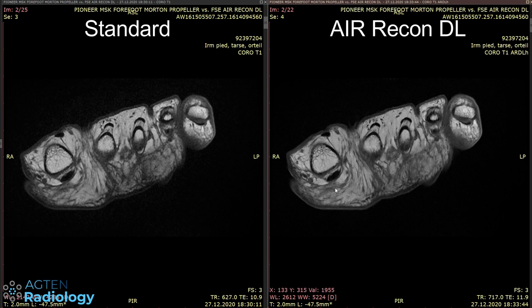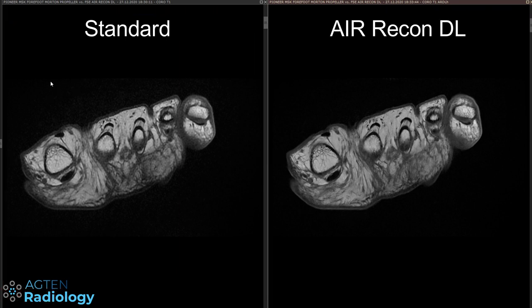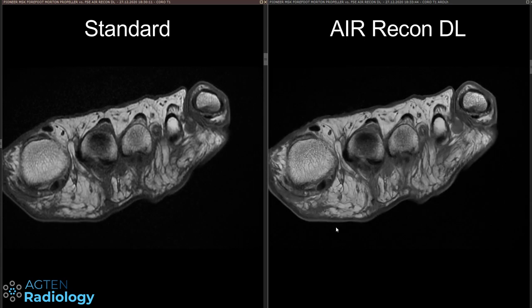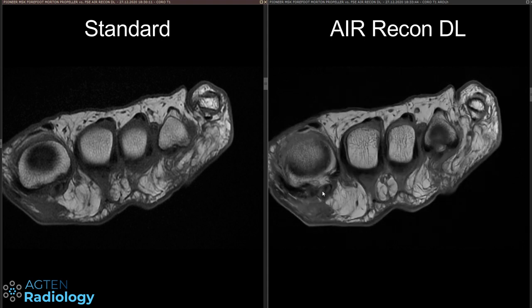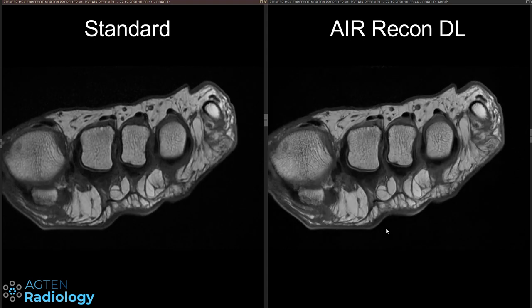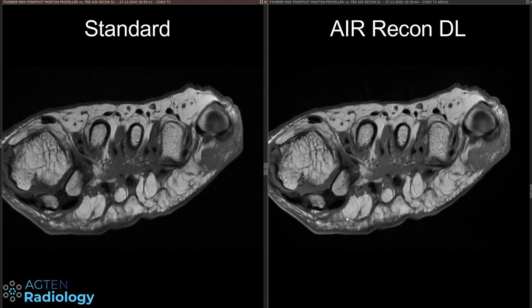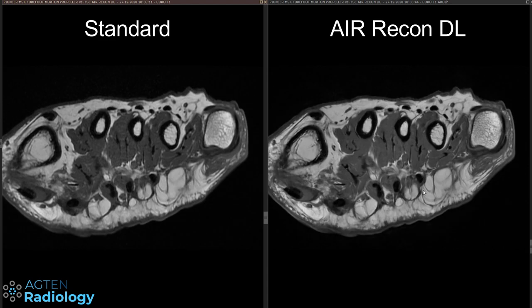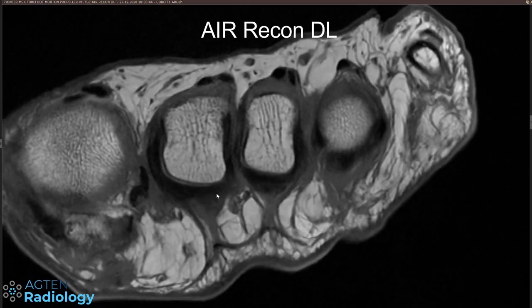Let's move on to the next case. This is a T1 — on the left is the standard one, on the right is with Air Recon DL, and the timestamp is different, so they may have actually scanned it twice, which means we have a real comparison of two sequences. What I notice right away is the bone looks really sharp — the trabecular structure looks really, really sharp. The cartilage and cortical bone look super crisp. It's a way sharper impression overall — very good and very impressive.